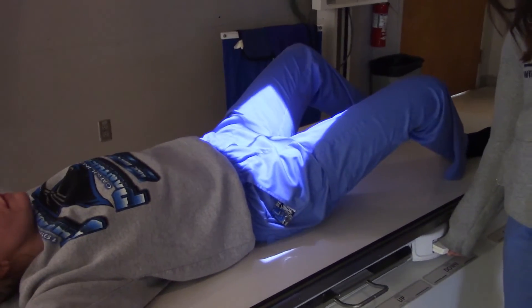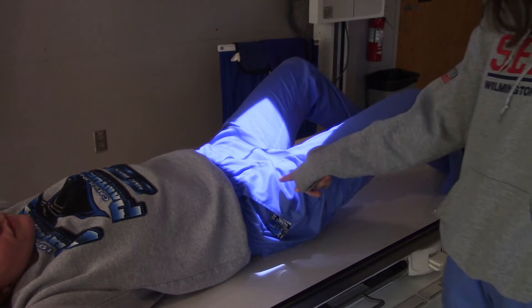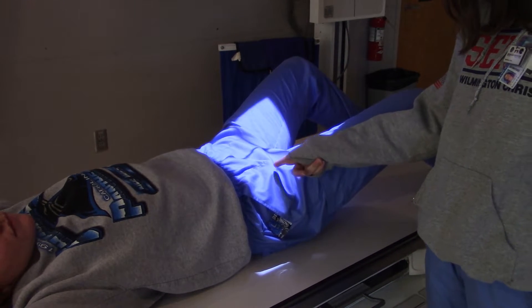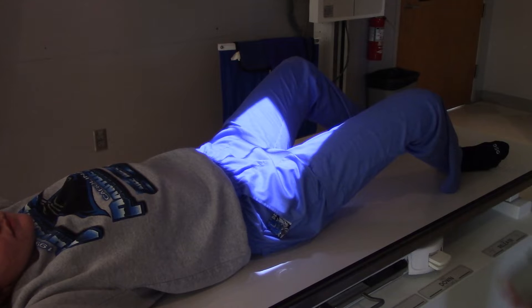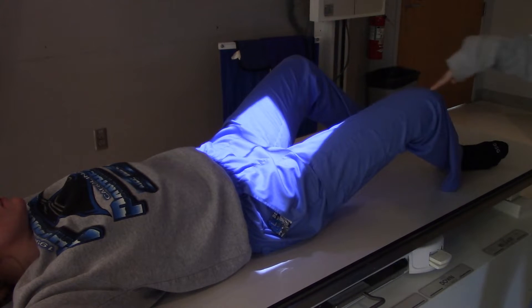Now, how did you position your patient? I go about three inches below the ASIS, and then I get her to pop her leg up so that this corner is in line with the knee.